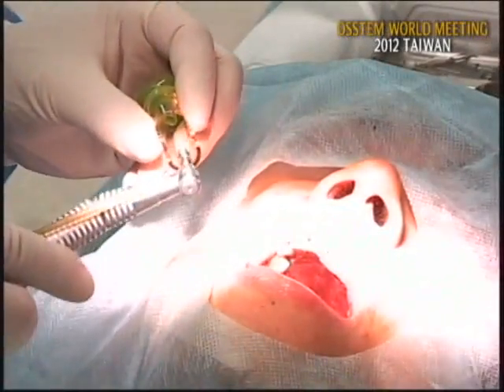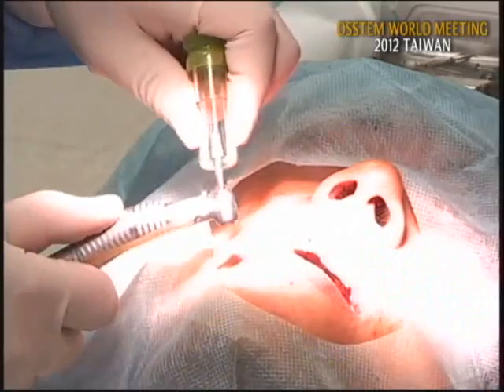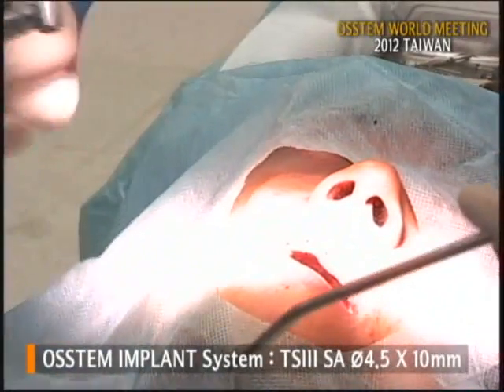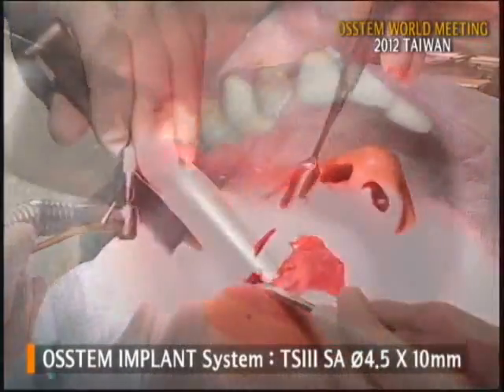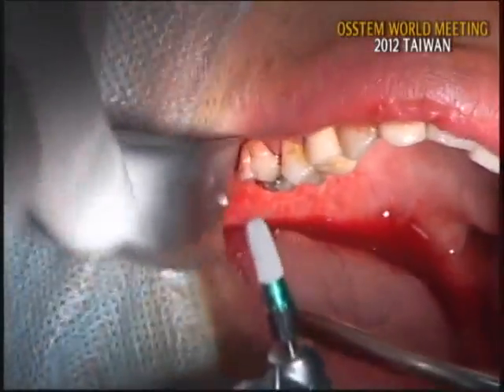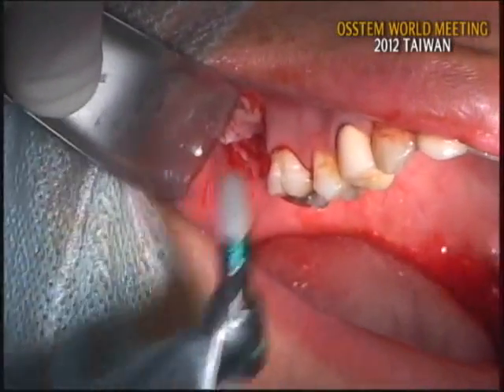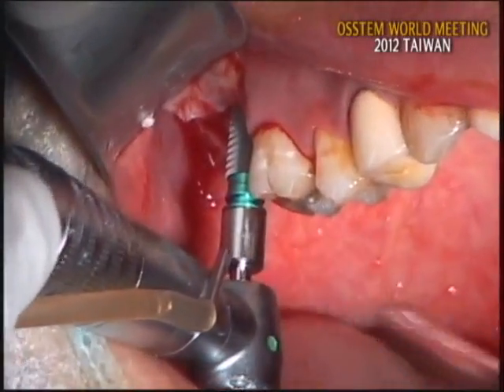Here is Osstem's TS3 SA 4.5 by 10 millimeter implant. Okay, the speed is 35 RPM, and I'll place the implant. Irrigation, please. Okay. Open, please.